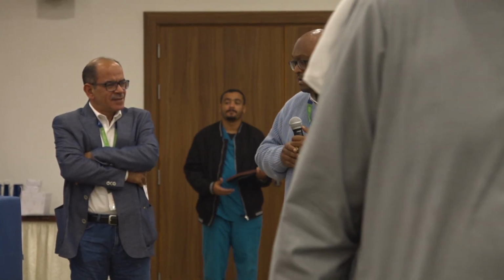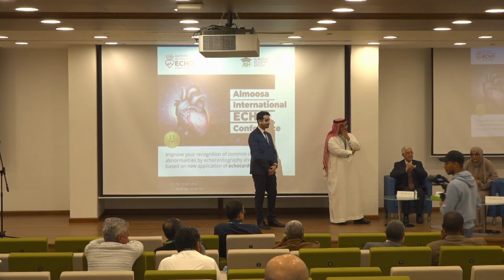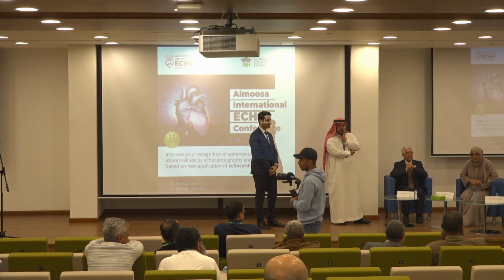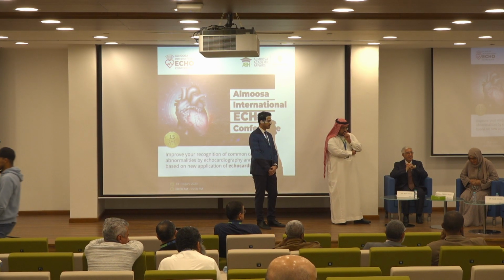And I have a second question to Dr. Hani about 3D echo and optimization of the 3D. Do you have a specific range for optimization when you have a 3D zoom to eliminate all the dropouts and the artifacts you see, in terms of the gain, compression, smoothing, and also thickness? If you have numbers or ranges you can give us, that would be nice.